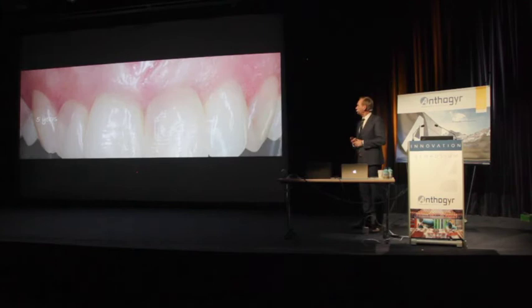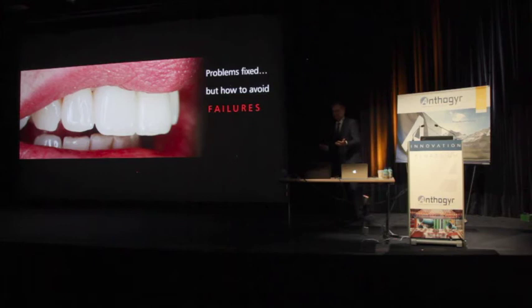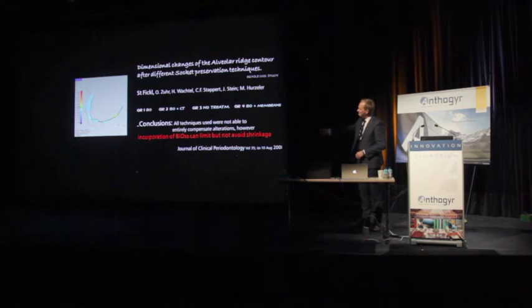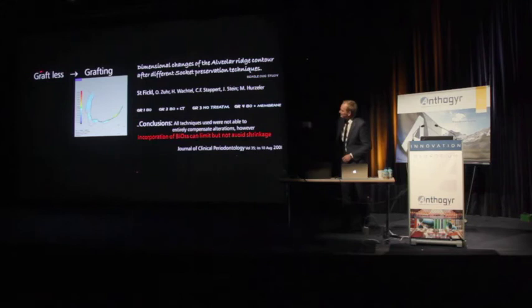So, we can fix the problems, but my first goal is to avoid any problems. And I'm very critical now on my hardware I'm using, and on the protocols, because sometimes we make a big mistake. We try to adapt a patient to a protocol. I think we should adapt the protocol to the patient, the other way around. And we know we lose bone after extractions, so it is not good not to graft. So we went from graftless to grafting.